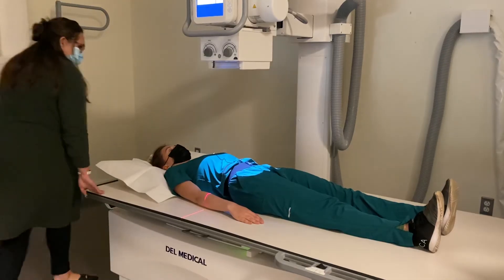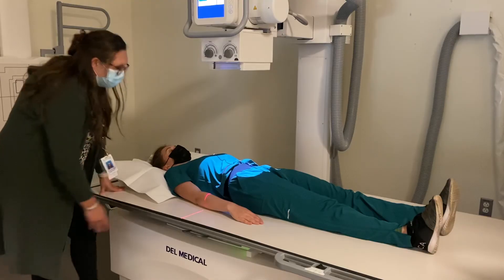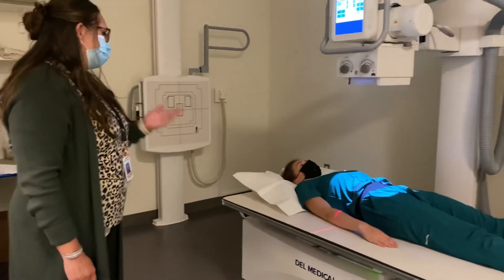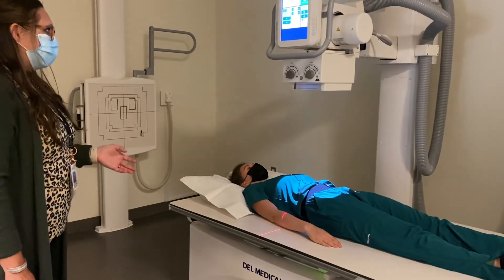Making sure that I'm centered to the mid-sagittal plane. I would have my patient stay just like that. I'm not shielding because it would obscure the anatomy. I'm going to have my patient take a breath, blow it out, and hold it out — and I would expose.